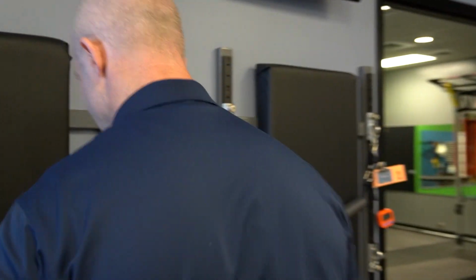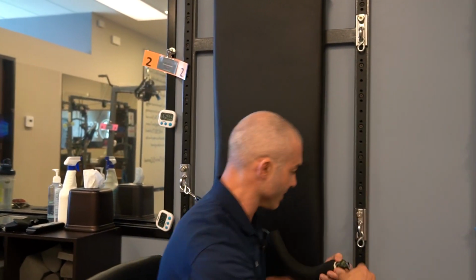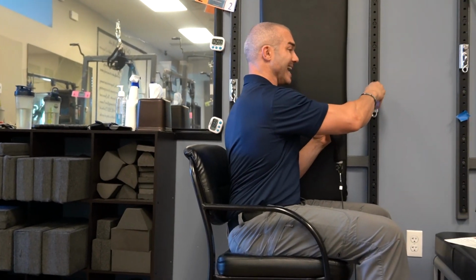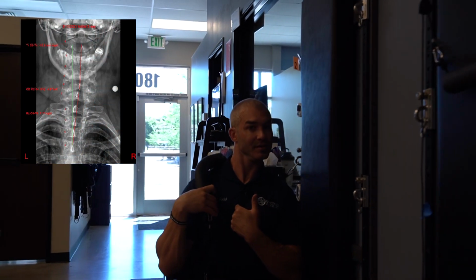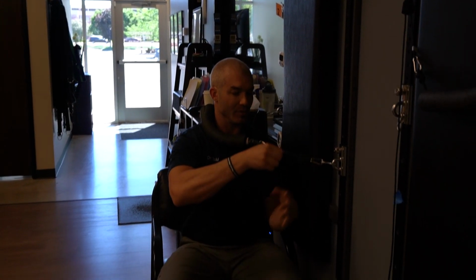All right, this is called a Meyers wall unit in honor of Dr. Don Meyers out in California, who invented this. How this works, these little sliders help us set the height because there's a specific angle that we're then going to pull across. In this case, the patient's head is shifted to the right compared to the rib cage, so we're trying to shift the head to the left. There are some other specifics on this I'm not going to cover in this video. I'm just showing you the quick gist of how it works.